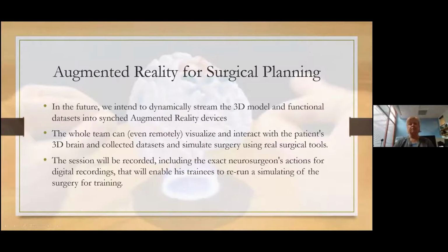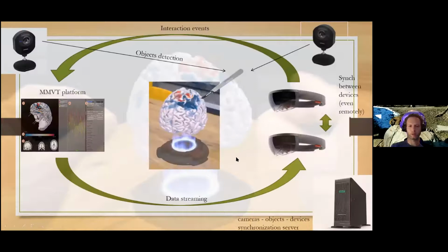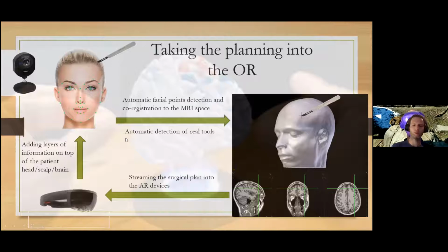Okay, so a bit about the augmented reality. This is how it's going to work. These are the Microsoft HoloLens devices that are synchronized to each other, and everything is dynamically streamed from MMVT. And the nice thing is that we want to take it in the future inside the OR.